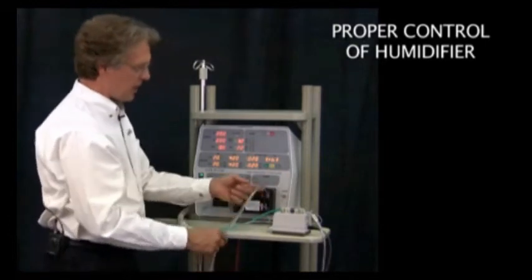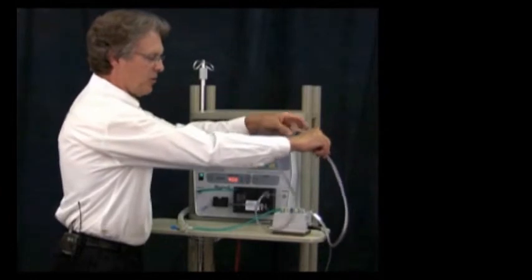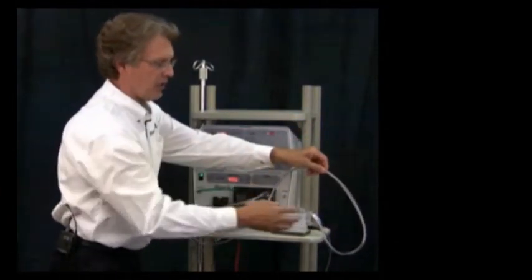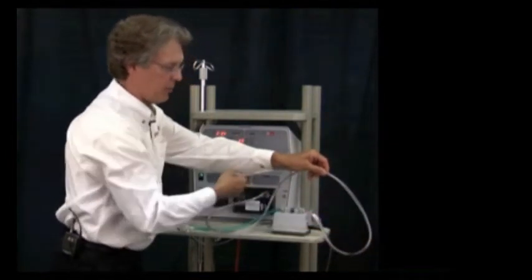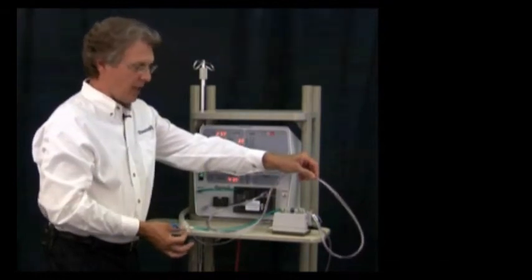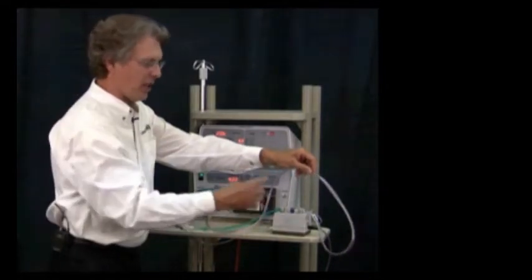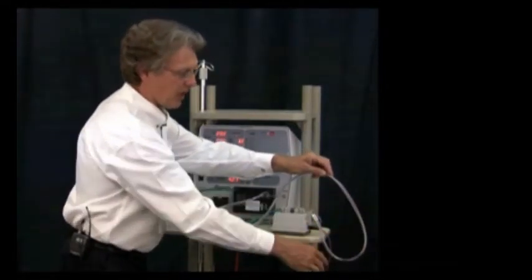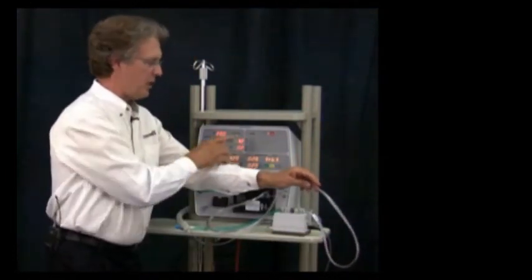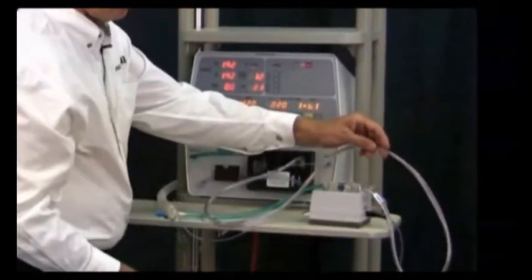What you want to do is manipulate the circuit in a way that allows you to move that water down toward the patient box. But you want to do that very carefully because there's gas flowing through the circuit. If there's a lot of water in here, the water can get picked up in the gas flow and pushed through the circuit into the baby's ET tube, and that would provide a lavage that probably isn't going to help your patient. So you want to be very careful in this process to make sure that there's not too much water. If the circuit is really flooded, then you only want to do this in the standby mode. But otherwise, you can move that water down to where it's caught in a loop of circuit just before the patient box.